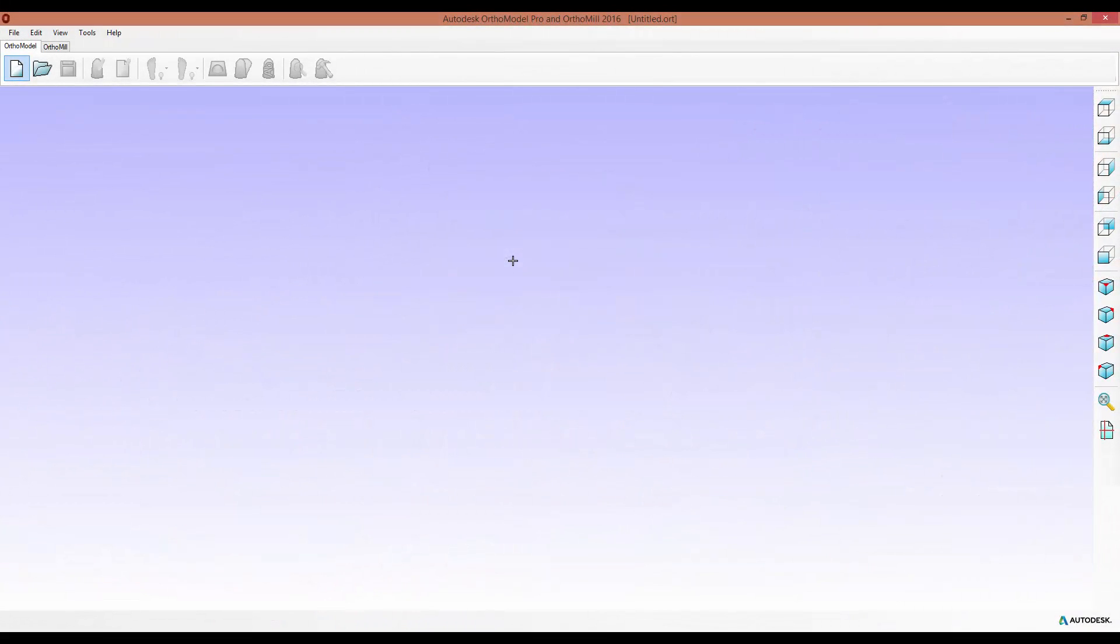Hello and welcome to this OrthoModel Pro video tutorial where I'm going to show you the two new tabs in the advanced editing tools for scans. In order to access this I first need to import a scan.